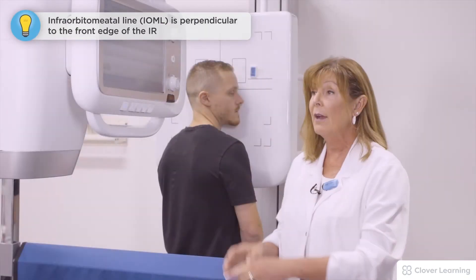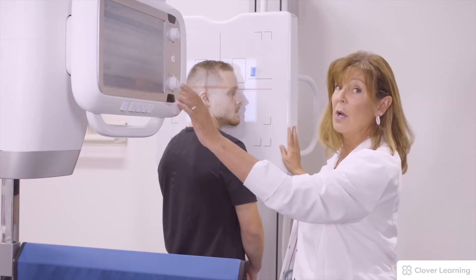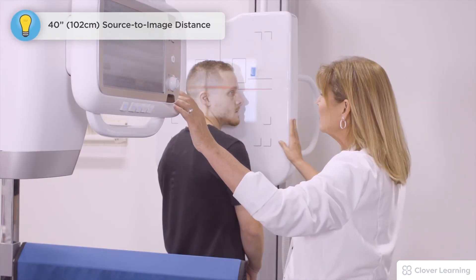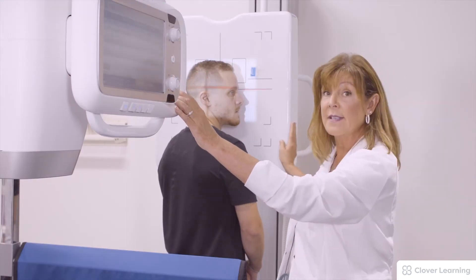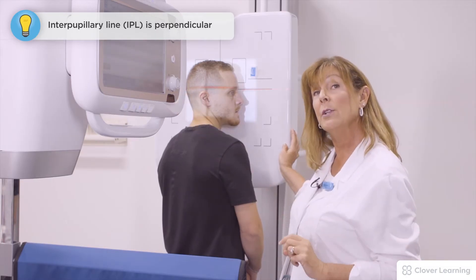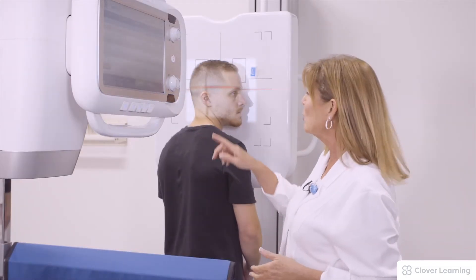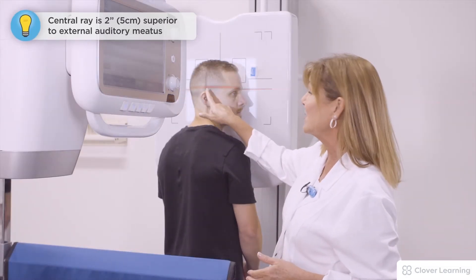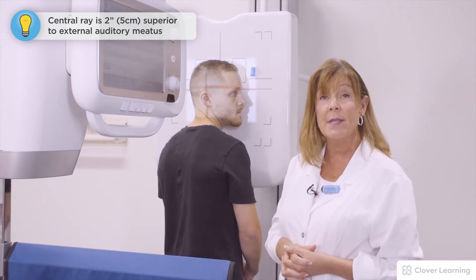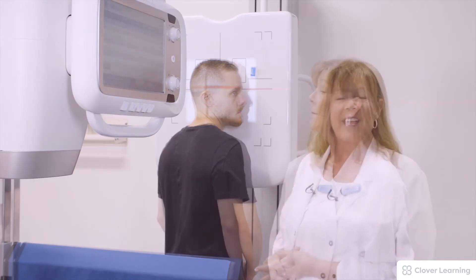I have no angle on the x-ray tube and I am at 40 inches distance. The inter pupillary line is perpendicular to the IR. The central ray is 2 inches superior to the EAM, the external auditory meatus.